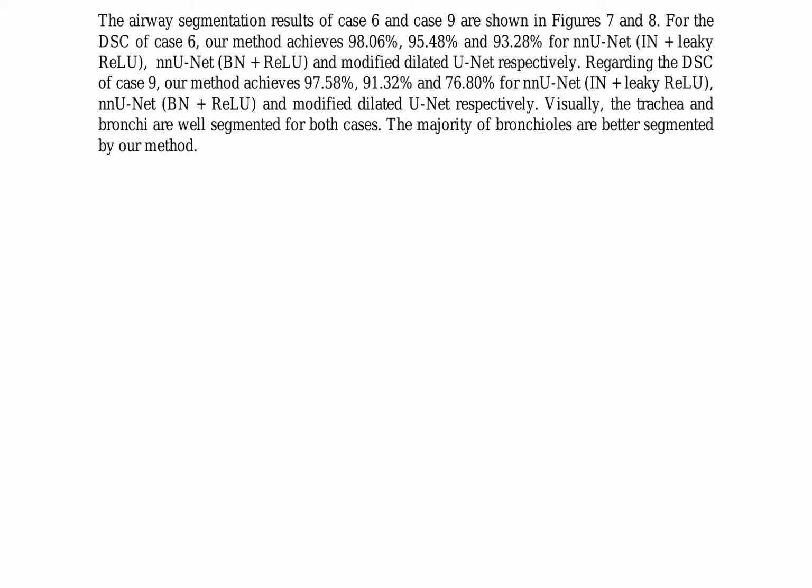Overall, the results demonstrate the effectiveness of the proposed data-centric method in improving airway segmentation performance, particularly in segmenting small airways such as bronchioles. The superior performance of the proposed method is attributed to its ability to better capture the nuances of airway anatomy and the variability in patient data. This is achieved through the interpolation-split method, which allows for more accurate interpolation of the airway tree and improved segmentation of small airways. The results presented here highlight the potential of the proposed method for improving airway segmentation performance in clinical applications.